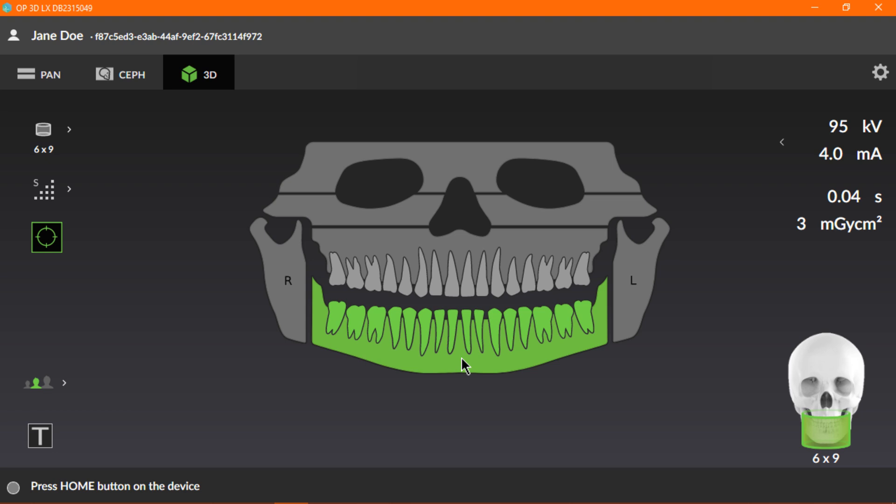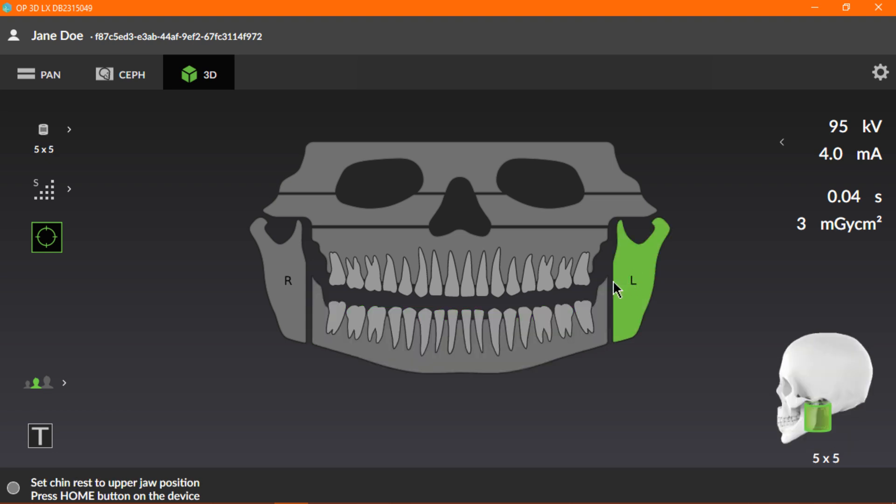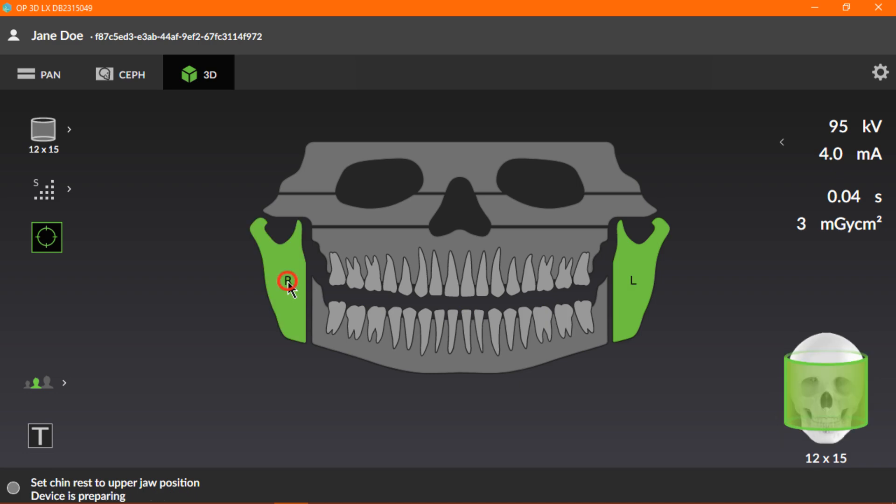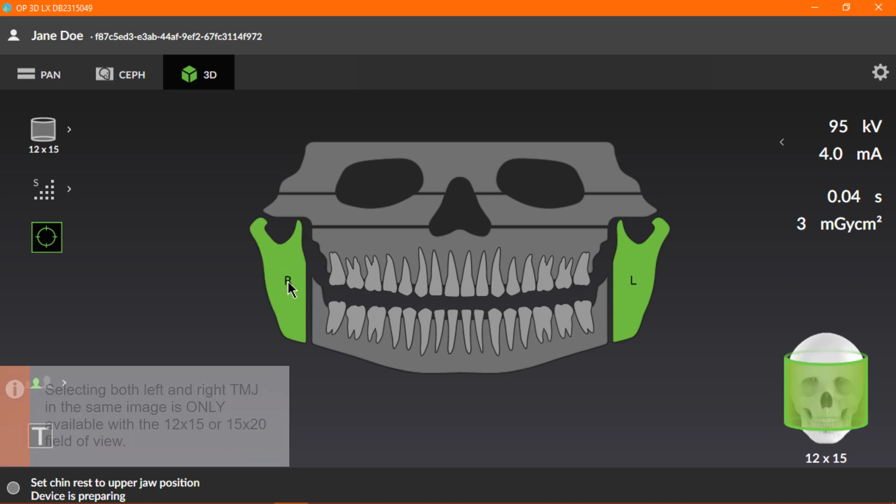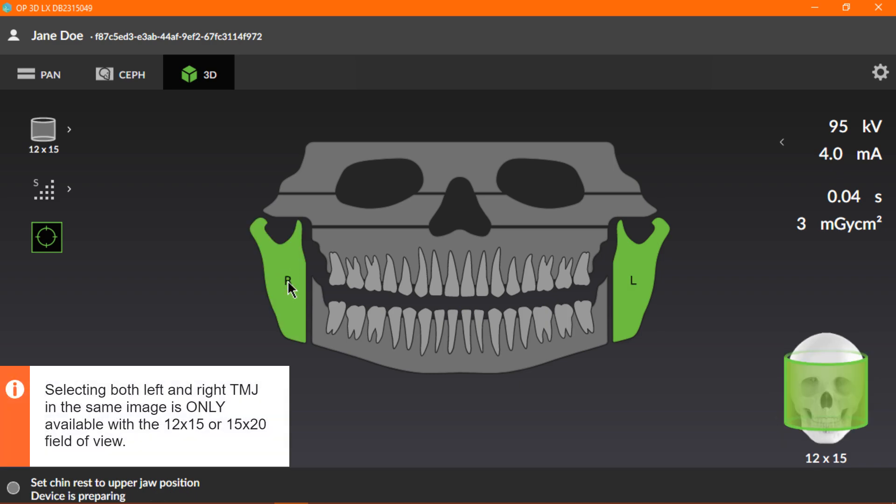You can select the jaw with all the teeth included, or the Temporomandibular Joints. Note, selecting both left and right TMJ in the same image is only available with the 12x15 or 15x20 field of view.